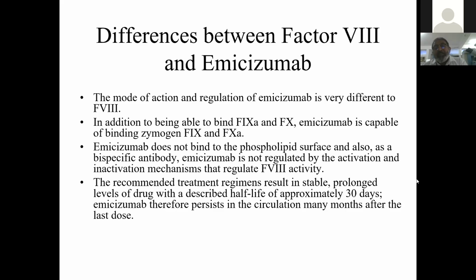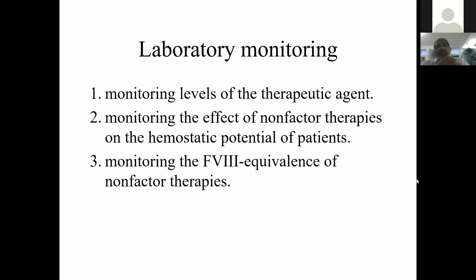The recommended treatment regimen results in stable, prolonged levels of drug with a described half-life of approximately 30 days, and therefore it persists in circulation many months after the last dose. So, laboratory monitoring is to monitor the level of the therapeutic agent, the effect of non-factor therapies on the hemostatic potential of the patient, and the factor VIII equivalence of non-factor therapy.